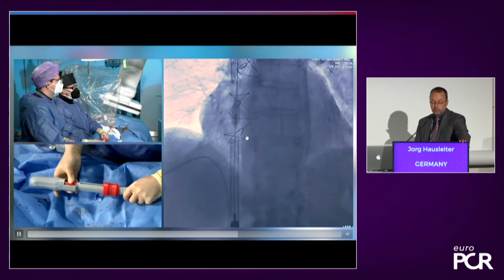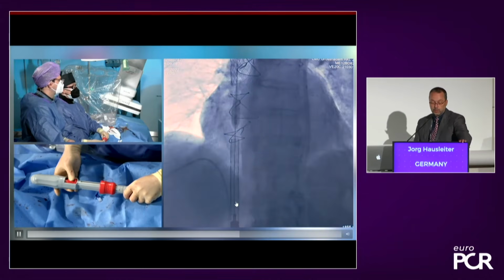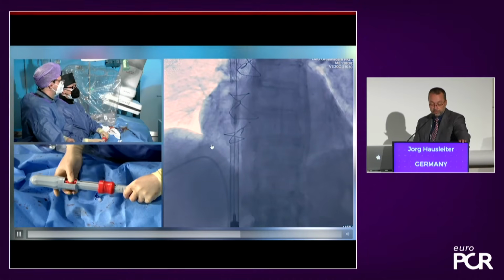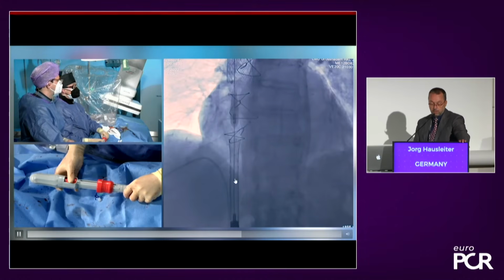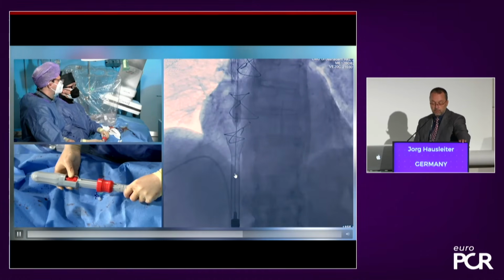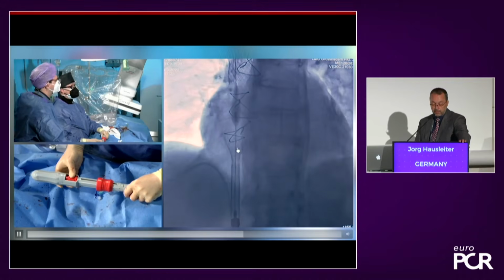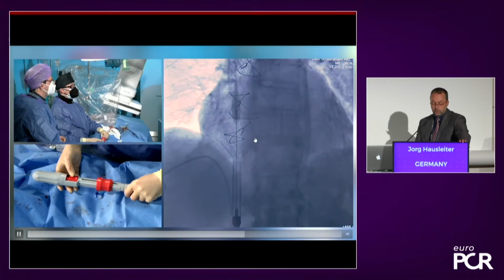And we can still retract the system, also the upper one, during the release, but we cannot insert the valve. So starting higher is easier and pulling back, but not the other way around. Now you see the system is flaring again in this position. We are orientating ourselves here also with the spine.